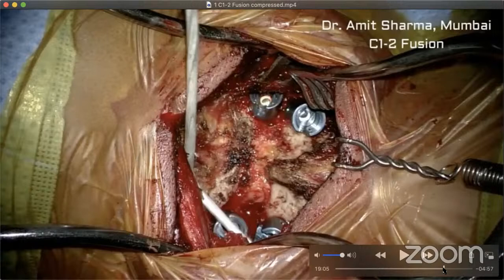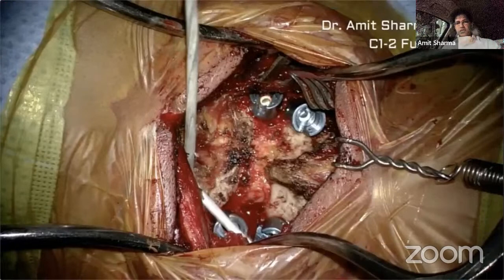Thank you. In very arthritic patients where the C1, C2 is very collapsed, how do you try to get your C1 screw? Because there's hardly any space. In those kind of situations, what I do, I resect off the C2 nerve root. So the lateral mass is seen a little better compared to what we saw in this video, because in this particular video the C2 nerve root was not resected off. That's one thing. Second thing, I'll put a kind of spacer inside the C1 C2 joint, so that will jack up the C1, so that will bring the lateral mass even more clearly in the picture. So these are the two things I do separately if I feel that there's significant subluxation or significant collapse of C1 over C2.